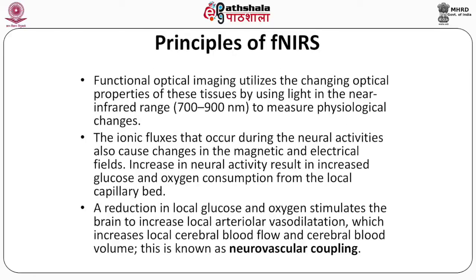So, the first and a pretty important topic of this module is the principles of FNIRS, under what mechanism it works.